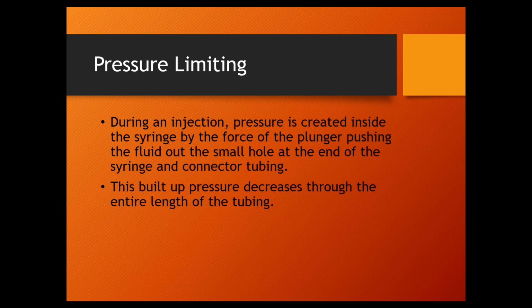And the reason for that is, we're here in the x-ray room. Besides contrast fluid, what else are we firing into the patient at this particular second? X-rays. If the injector stops, we have to do this again, which means that was all wasted dose into the patient. So if the injector hits its pressure limit during the actual procedure, it doesn't stop the injection.